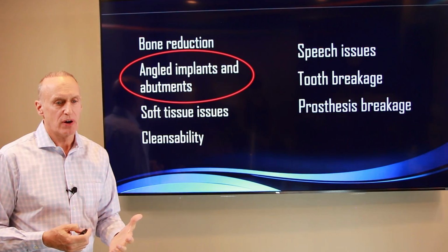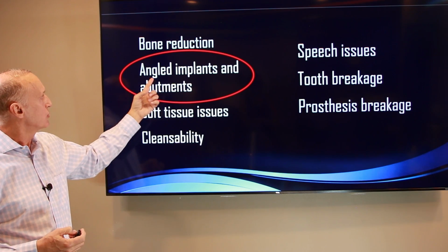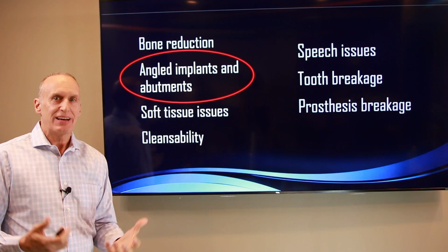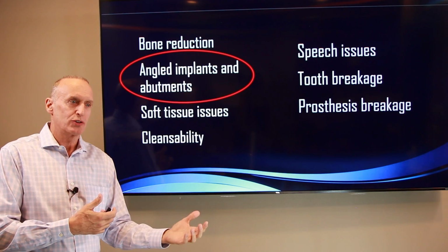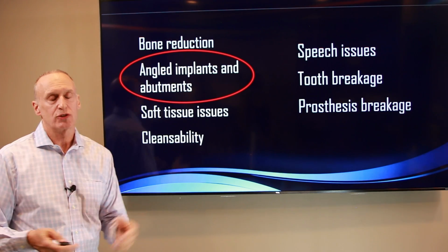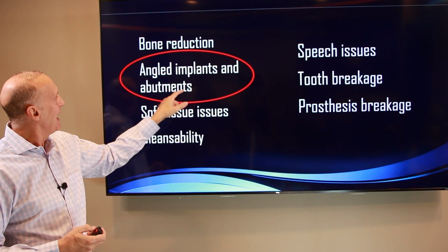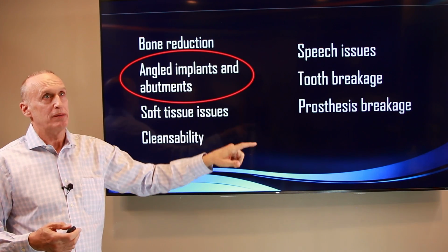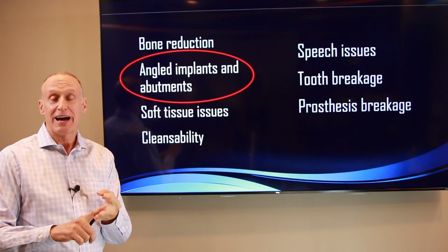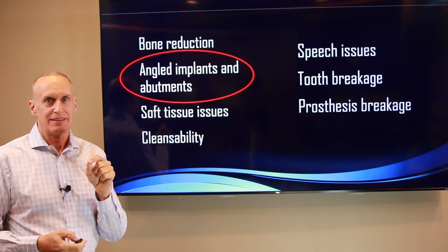So the second problem with All-On-4, that giant step backwards that I talked to you about earlier, is the use of angled implants and angled abutments. In order to go even faster, either be done with your surgery sooner or see more patients every day, the implant surgeons were now putting implants in fast because we've got angle correction abutments. They come in 17 degrees, 30 degrees, and I believe now they're even up to 45 degrees of angulation correction.